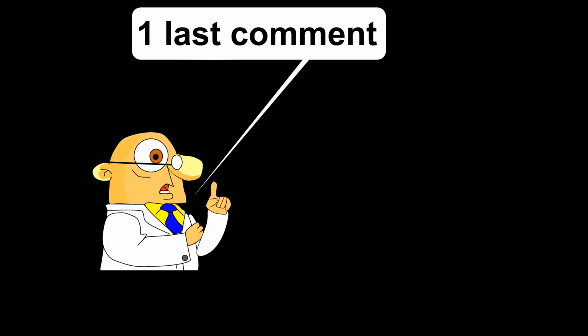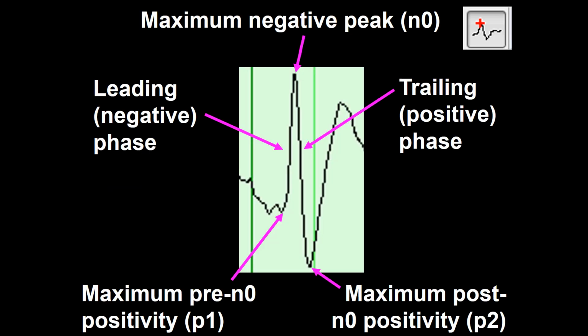The last point I'd like to make in the conversational section of this talk is about describing EEG waves. The reason for this is that most articles in the EEG literature talk about wave configuration, amplitude, and duration without telling us exactly how they went about measuring them.